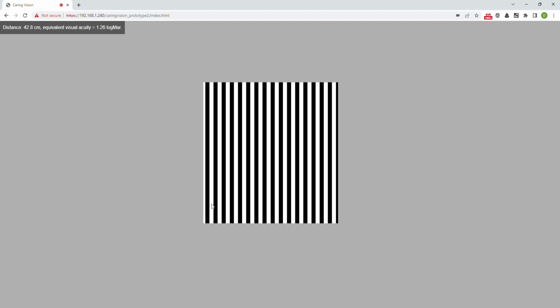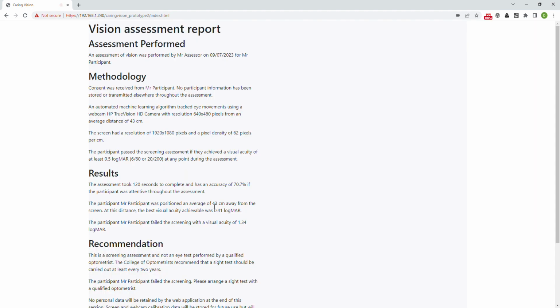But in future prototypes, of course, it will be adaptive, so the number of presentations will vary depending on how good or misbehaving the candidate is who's doing the test. But at the end of that, of course, we should end up with a report, which will come on the screen very shortly and will tell you how good or bad I am. I have a feeling I'm going to fail the test because I'm not really paying attention, but we'll soon find out. You'll notice that I haven't touched or moved the mouse in any way during this assessment. I don't need to. This has all been controlled using the webcam.